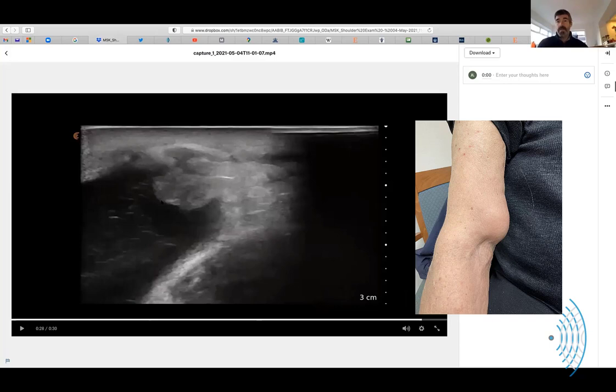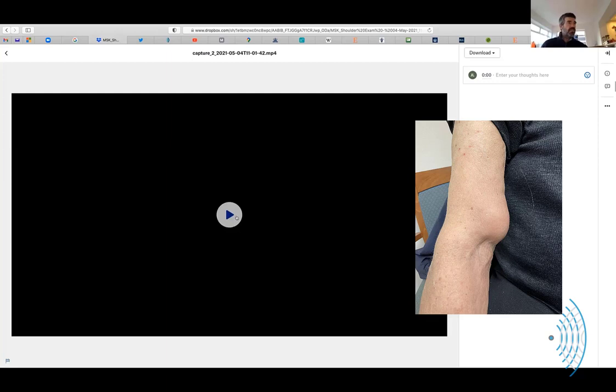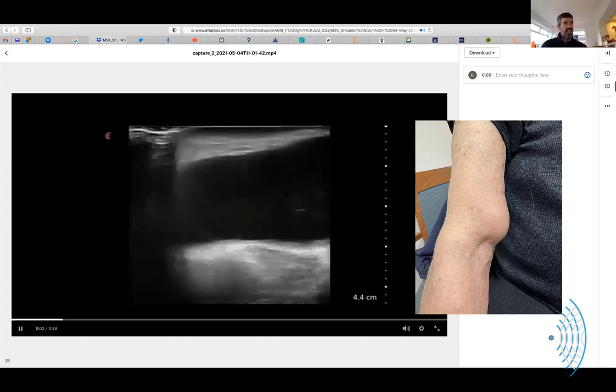What would it be? Would it be an amber shade? Could you suck it out like it was jello through a huge needle, or do you just watch this sucker? I think you'd probably watch it, because it's just a big hematoma that's got all gungy and sticky. You see all these echoes in there? Yeah. It isn't the only thing that can look like that, but it's a very good thing for it. You've got all this crap here, and it's just the fibrin coming out.